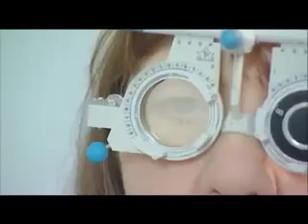There are no numbers on the chart, only letters. If you're not sure about what one of the letters is, I'd like you to make a guess at what you think it might be. I'd like you to read those letters at a nice regular rate of about one letter per second — so that's A, B, C, and so on. If you need to turn your head to try and see some of the letters, that's fine, but please don't try to look with your other eye. Also try to stay sitting nice and upright in your chair and not leaning forward.